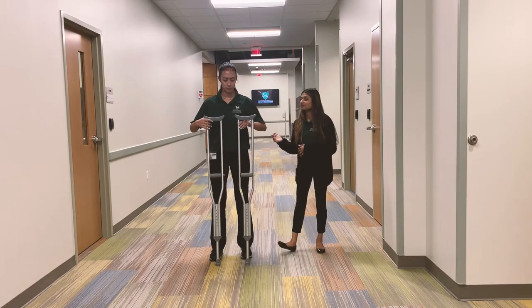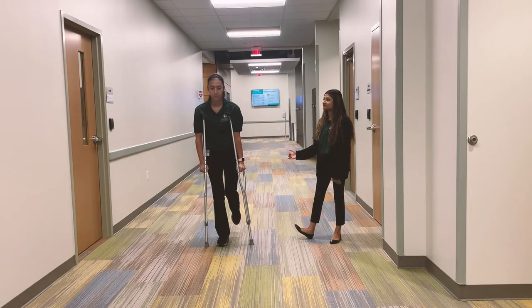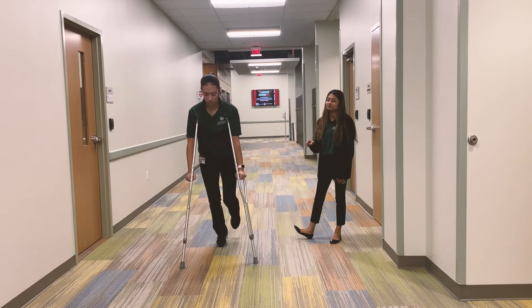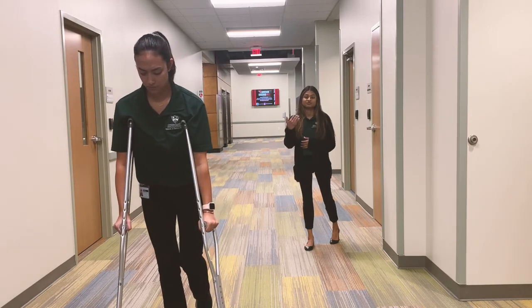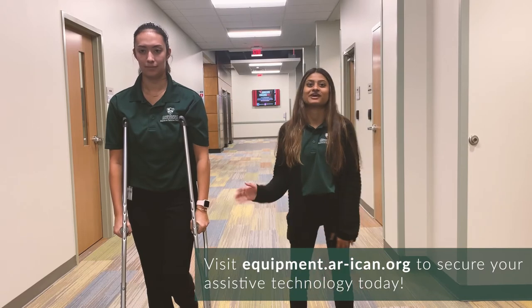So my friend here will demonstrate how to use them. Right now she is on her uninjured leg, supporting all her body weight on her uninjured leg while her injured leg is bent and in the air. She is going to advance the crutches one foot forward in front of her, then support all her weight onto the crutches while she's moving forward. This item is available in the ICAN Lab here at AIC.